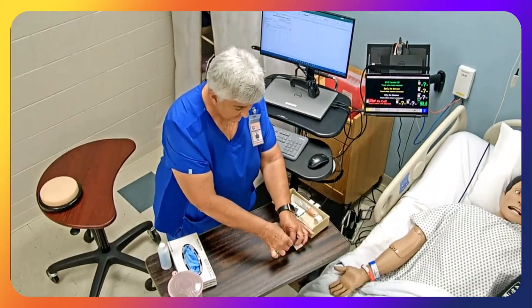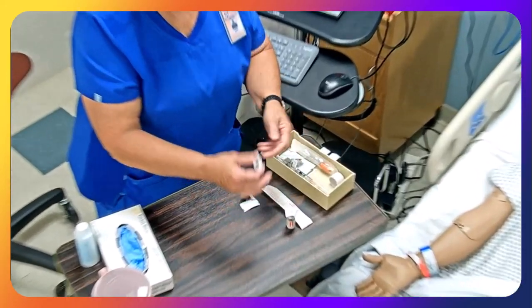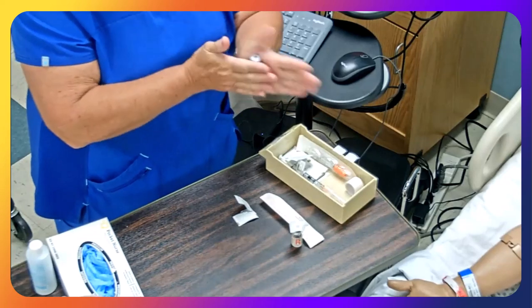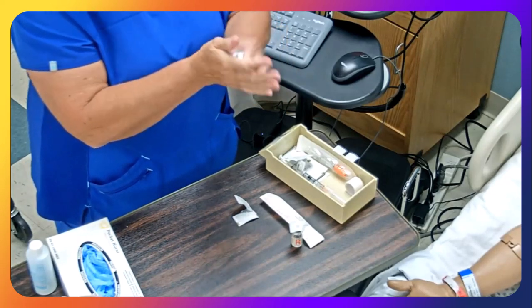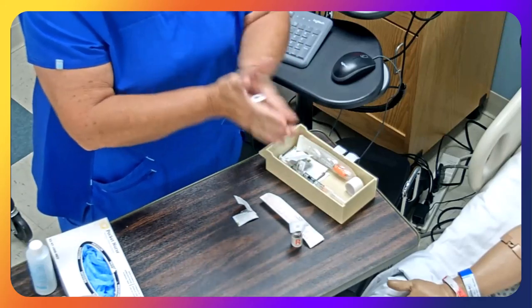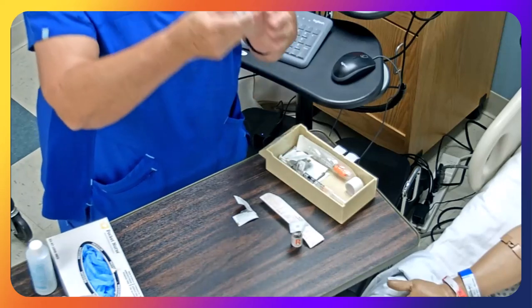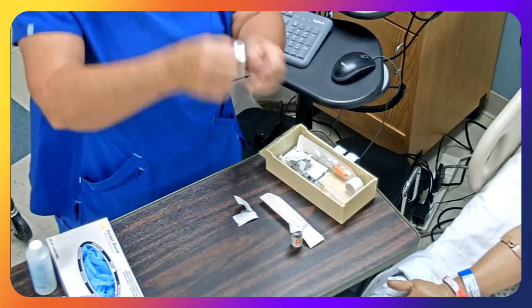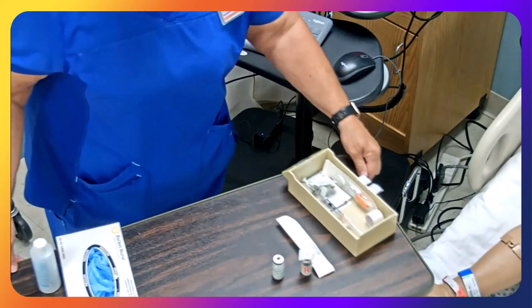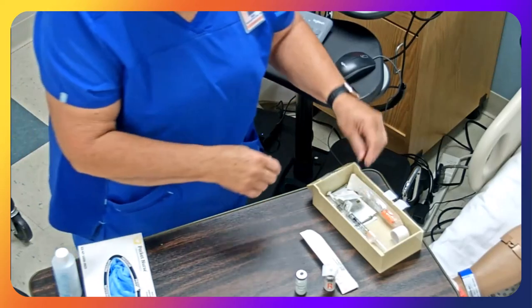So we're going to go ahead and, with the NPH insulin, you need to roll it because of the precipitate, we need to mix it with the solute, and so we're just going to roll it. You don't shake it. Okay, make sure all of it is mixed.